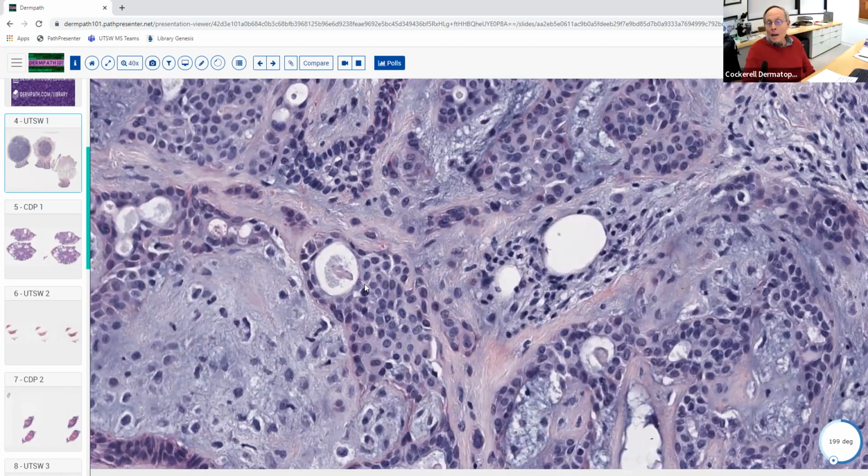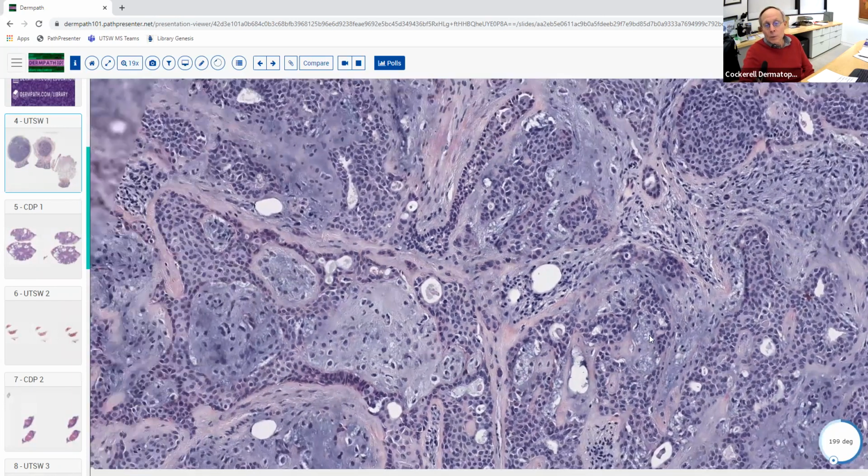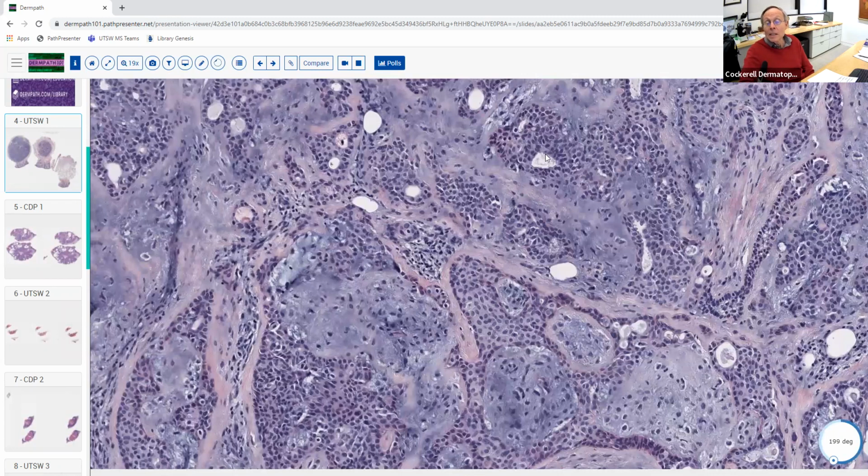Yeah, good. Apocrine or eccrine. Again, I'm not a huge how-many-angels-dance-on-the-head-of-a-pin kind of guy with regard to these. Basically, if you get into that category, I really don't care. I mean, guys argue whether this lesion is eccrine versus apocrine. I just think those arguments are kind of wasted. But basically, you can make the diagnosis of this specific entity. So you've got an adnexal neoplasm, ductal differentiation, glandular differentiation.